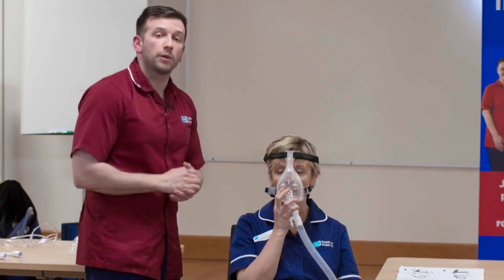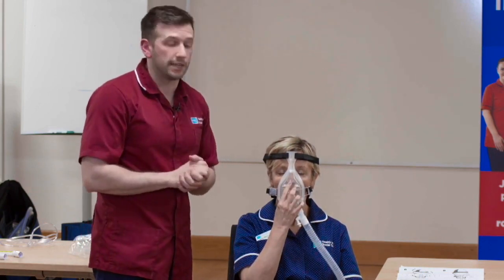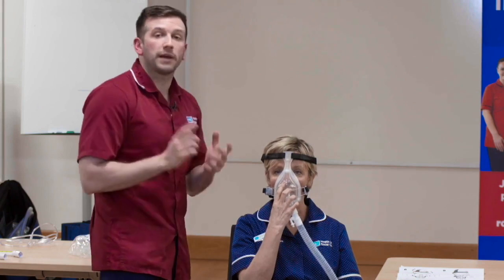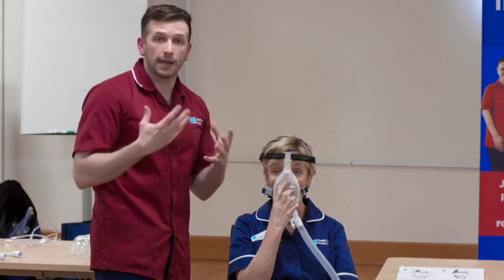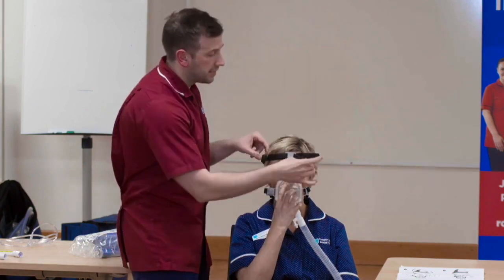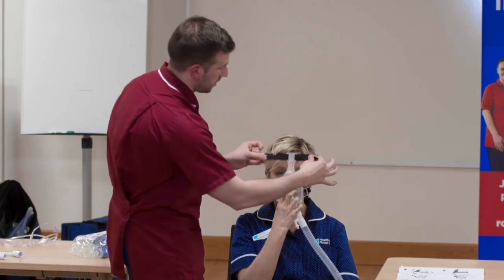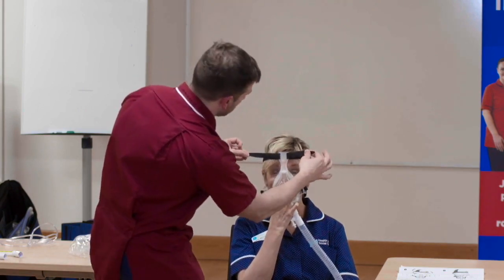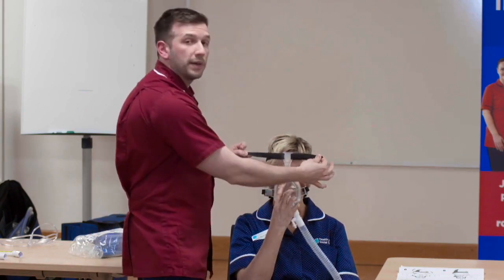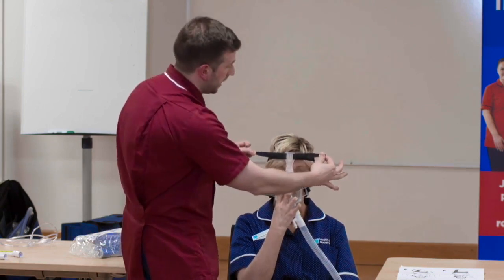Next, what I will do is I will look to adjust the straps to help to keep the interface secure and in place. I will start by adjusting the top straps, and I would like to do them both simultaneously. Are you doing okay, Anne-Marie? Mm-hmm. You can see that they are Velcro straps. Ask your patient and reassure them that it's not too tight or uncomfortable, and adjust as so.